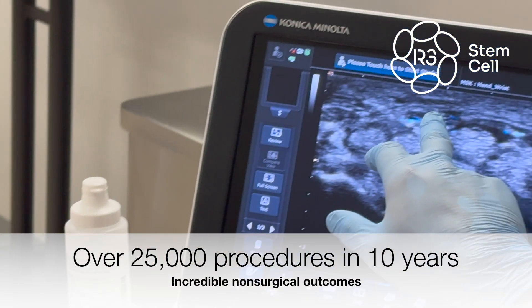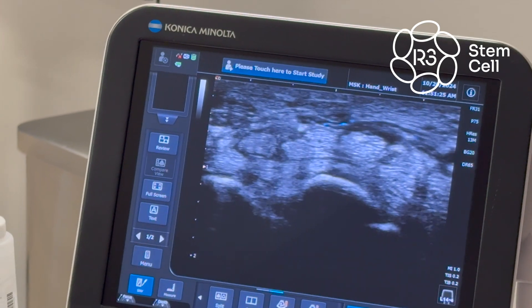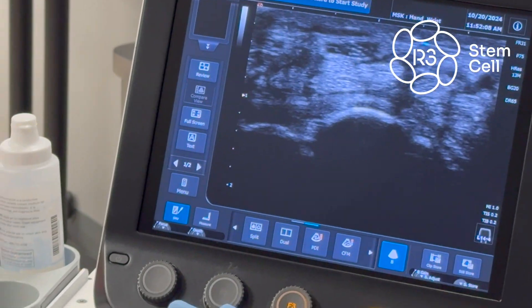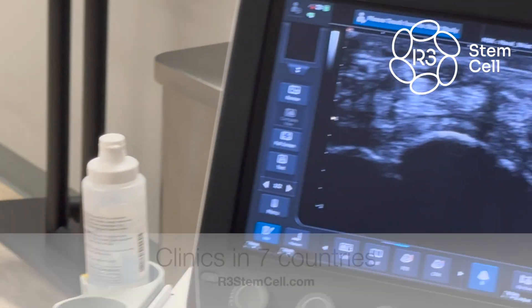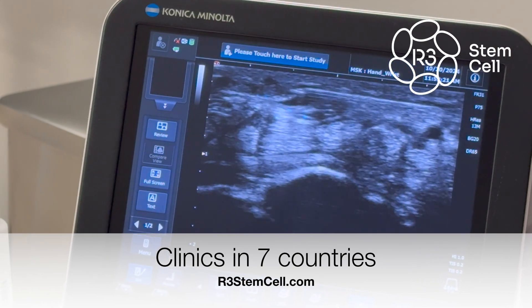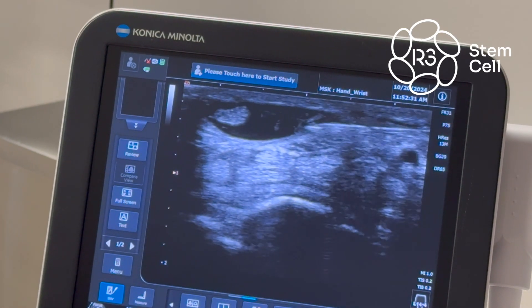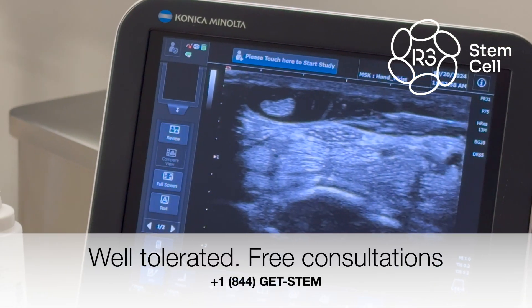We're actually right into the nerve right there, so avoid that. Come back a little bit so you can put his hand more that way. Here's your needle right there — on a straight line. Keep coming, perfect, right there. All of it right there — we'll push that needle down, push that nerve down. See it's separating it out from the tissue? Come back, keep coming back all the way out. That's all of it and we're out.